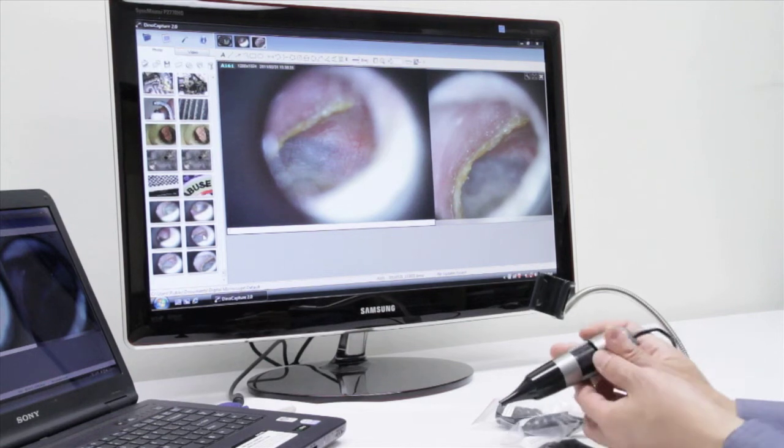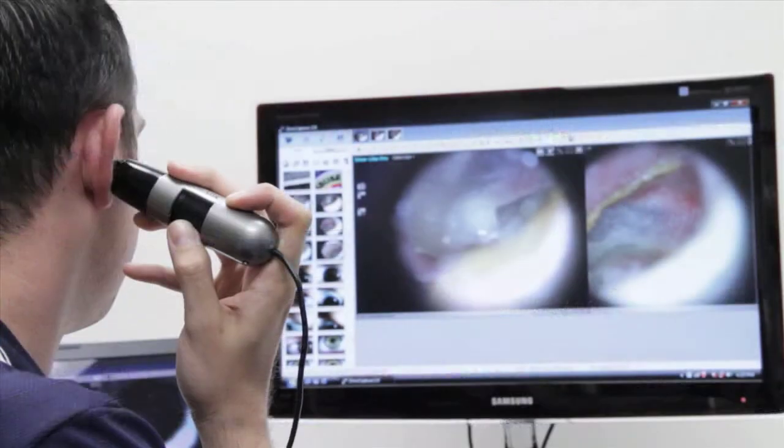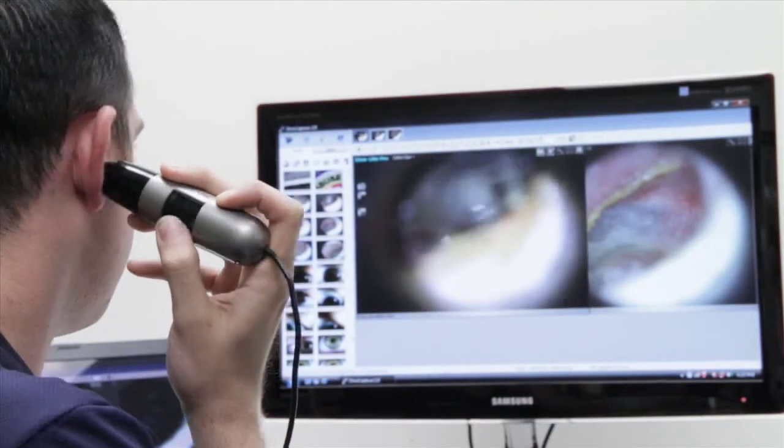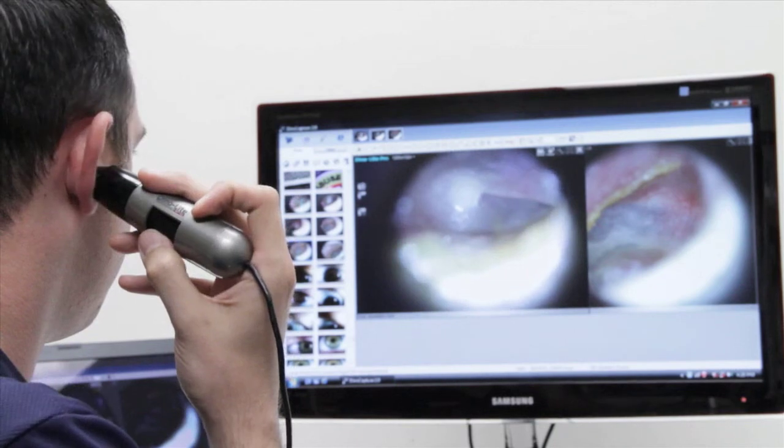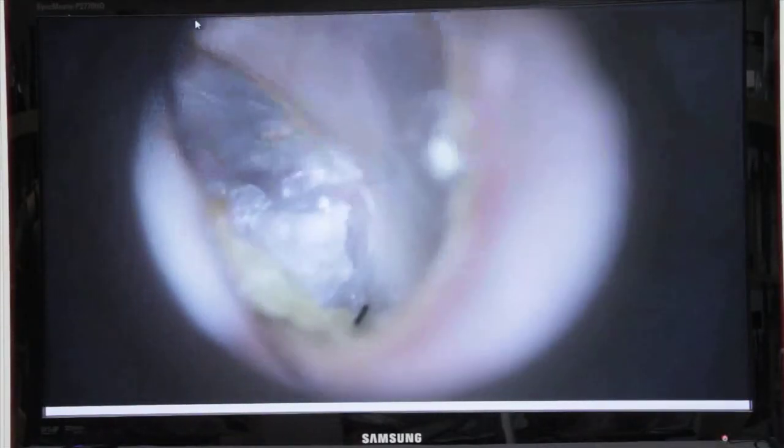You will also find a rotary dial on the side of the unit that adjusts the focus and magnification. The depth of field will allow you to focus on things a little closer or further away. The EUT V3 is very user friendly, making one-handed self examinations fast and easy.